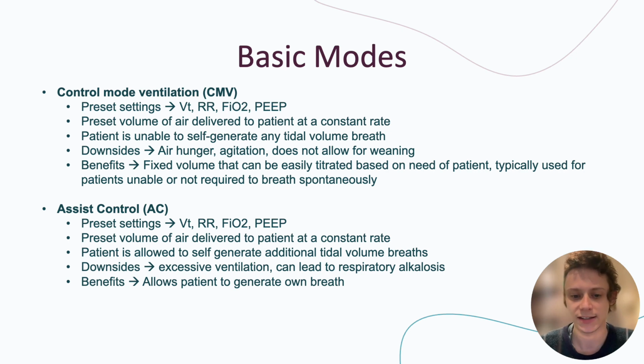Some of the downsides is this can lead to excessive ventilation. The patient will be getting a full tidal volume every time they try and take their own breath. This can lead to some respiratory alkalosis. However, the benefit is the patient is allowed to generate their own breath. So they're using their own lungs.